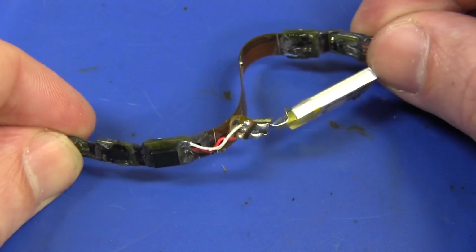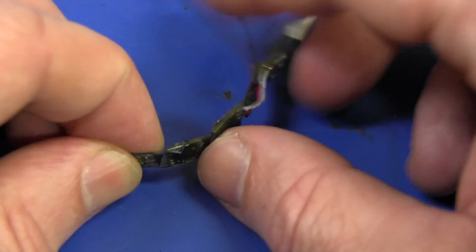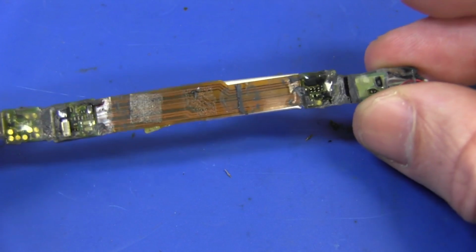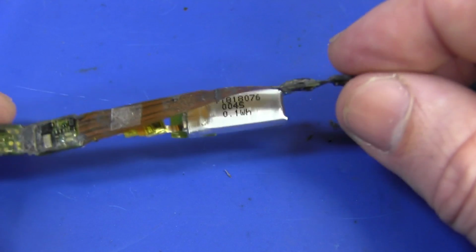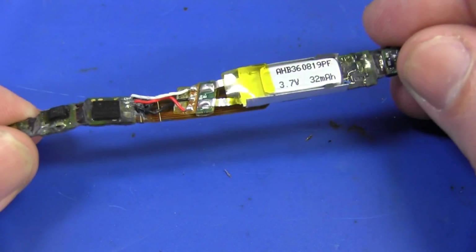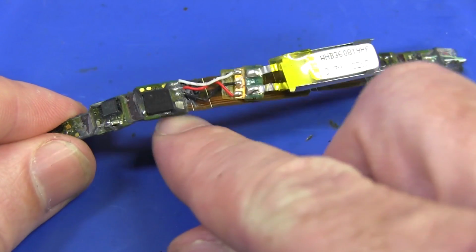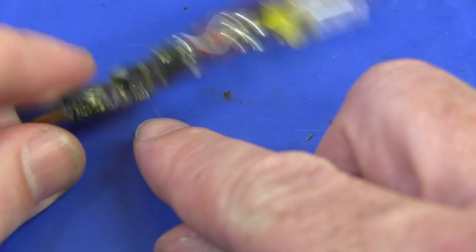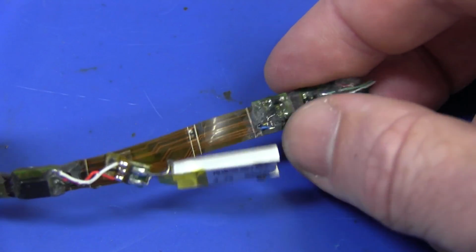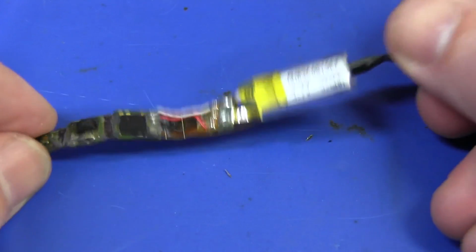They can be a real pain in the butt, and you're never going to get it first go in production, and you end up with all sorts of yield problems in production and all sorts of horrors like that, which you're at best avoiding if at all possible. But of course, to get this sort of form factor, this is what you've got to do. I wouldn't have used so many, I don't think, but it makes sense to separate the boards: separate processor board, separate battery charger board, separate serial prom board, separate amplifier board, and separate interface board, I guess. There you go.